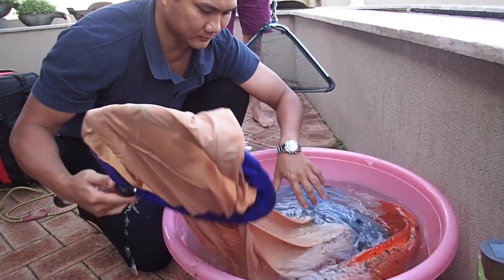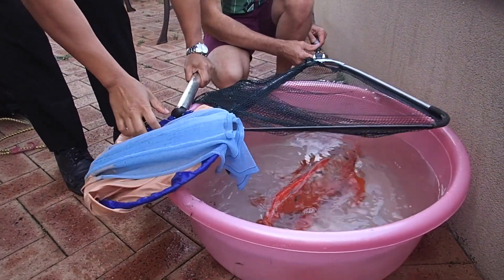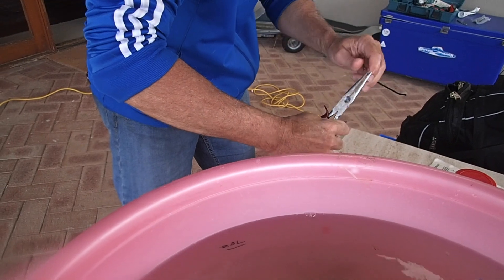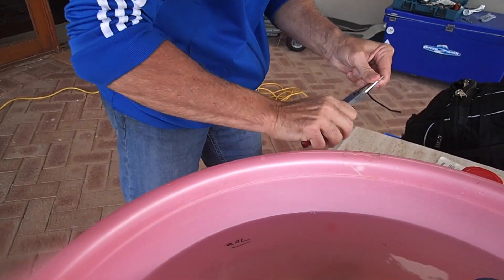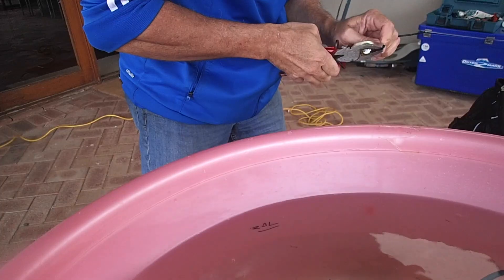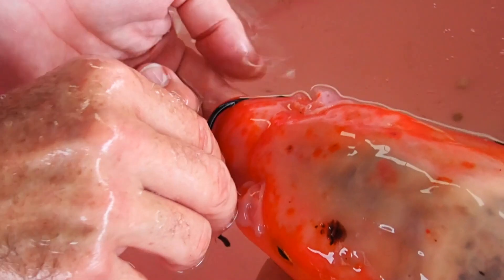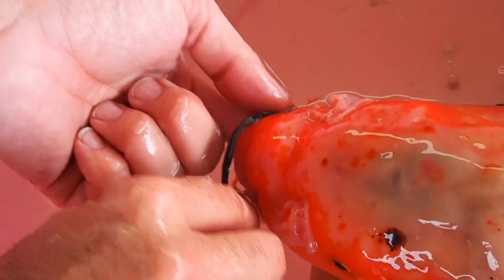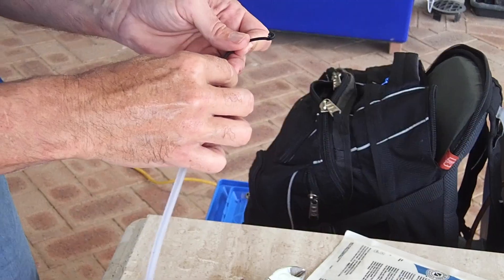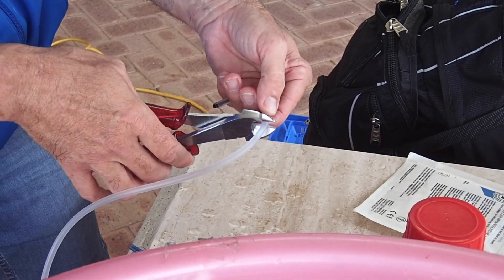This procedure that we're about to do is going to be a painful one, so this is the reason why we're using anaesthetics. We're fashioning a piece of wire to act as an external fixateur, commonly known as a mouth splint or a brace. This will hold the broken parts of the jaw together still so that it can heal properly. Now this piece of metal is going to be hard against the lips, so we're going to put some airline tubing — soft silicone — to make for comfort and also to attach stitches to.